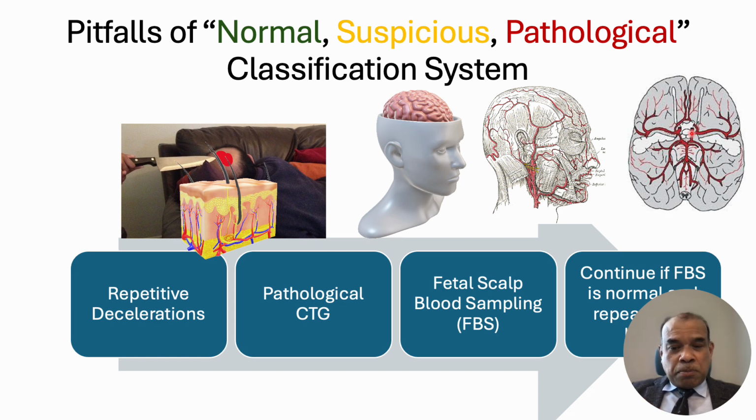When they are exposed to hypoxic stress, when they release catecholamines, they divert the oxygen by constricting all these skin blood vessels in the dermis to the central organs. So if a crazy obstetrician goes and cuts the epidermis and the dermis here superficially, that will be acidotic, and that is normal. And the poor woman is going to have an unnecessary cesarean section based on this wrong result, treating physiology as pathology.